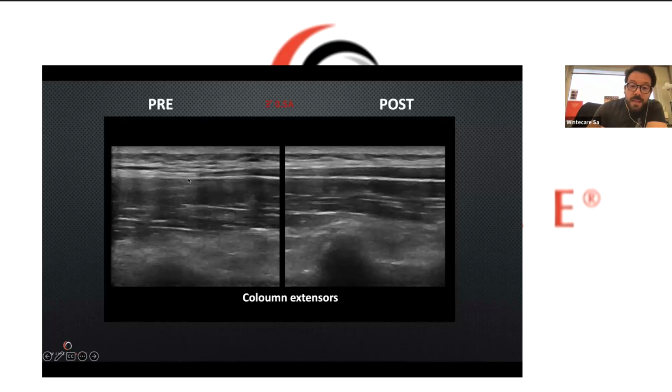And this is due to the fact that the superficial fascia is not totally separated from the deep fascia. 3 minutes, 0.5 ampere with a T plus, and here is the result. Okay, so a detachment, space, okay, space that allows the muscles to glide between each other easily.